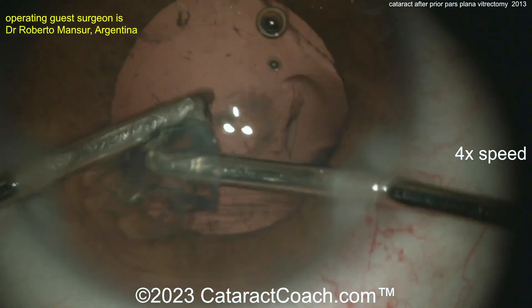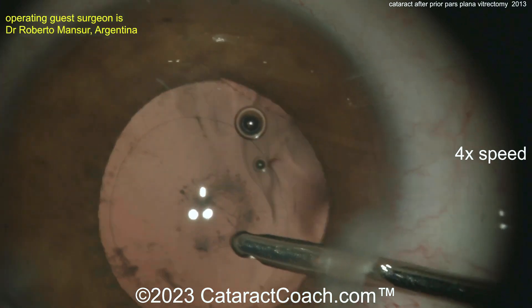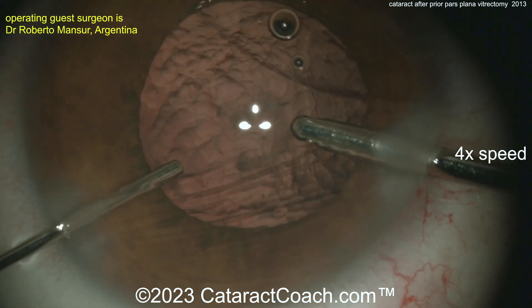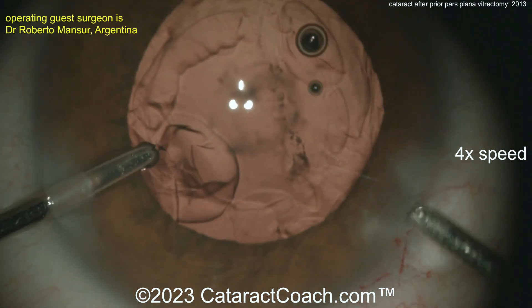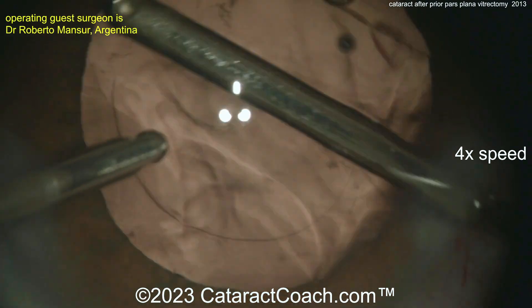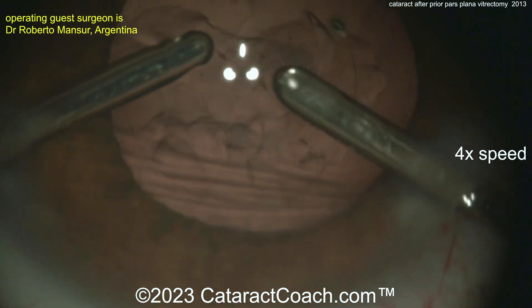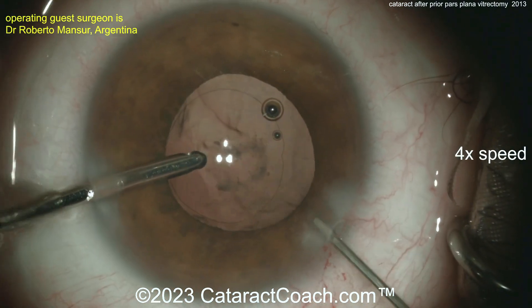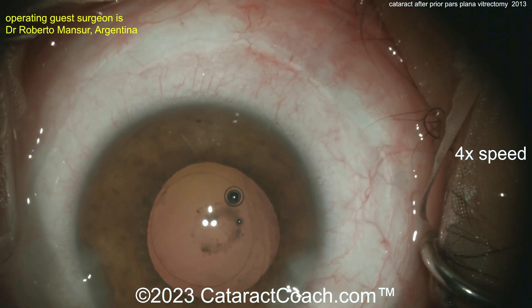Looking back there, the posterior capsule looks intact, but there's that one spot where it looks pretty damaged. So what should you do here? You can go ahead and just put the lens in, or you can also do a posterior capsulorhexis. Remember, the patient has already had a full vitrectomy, so there's going to be no vitreous prolapse. Doing a posterior capsulorhexis would be pretty straightforward — just poke into the capsule when it's full of viscoelastic and create a round capsulorhexis. But you've got to be careful on that one spot. You can just leave it alone — it's okay to just YAG it later. That's an easy solution as well.